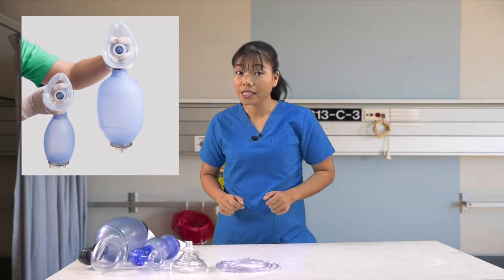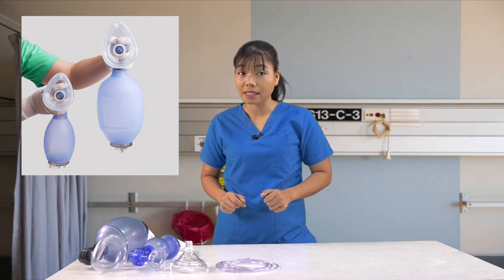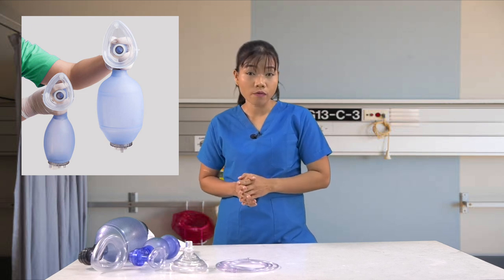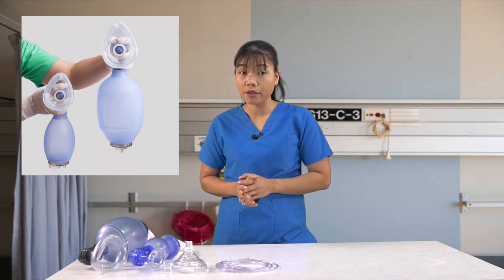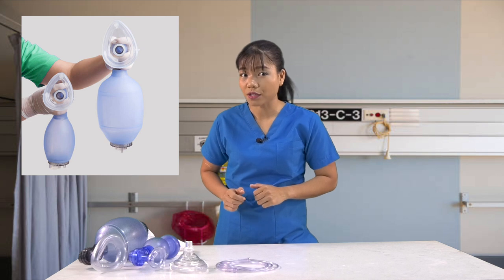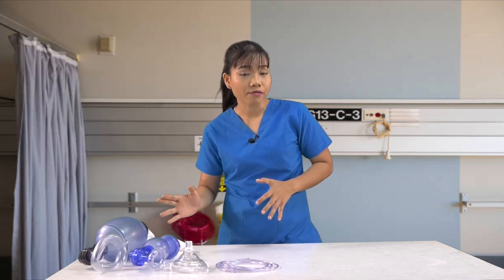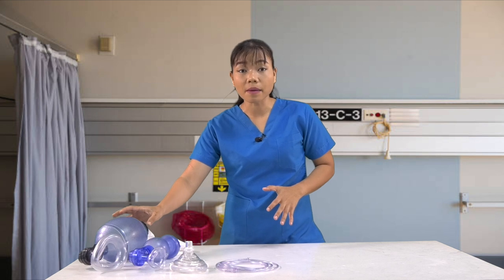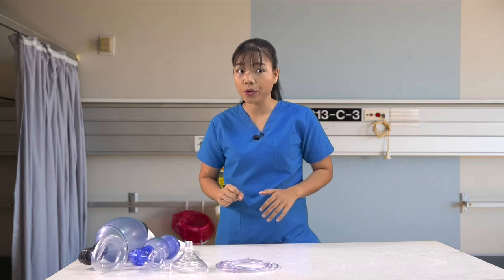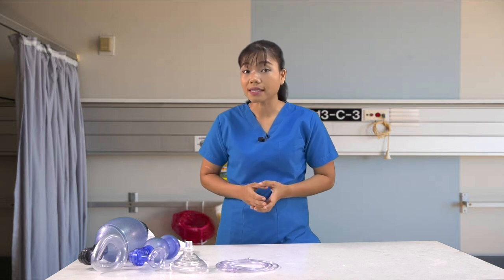There are two sizes of bag valve masks: infant and adult or child. The mask sizes are obviously different, but so are the bag sizes, as they deliver different amounts of air into the lungs. If you only have the adult size bag mask, it is not recommended to use it in infants. Only use the appropriately sized bag valve mask. Ideally, you'll have both sizes. It's always important to have the right size tool for the right size of the patient.